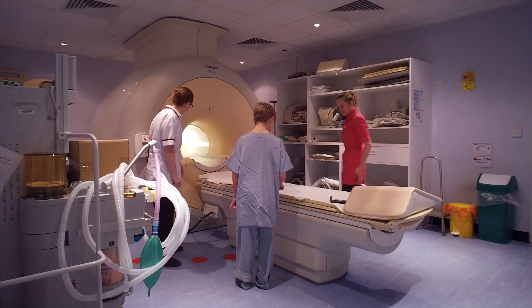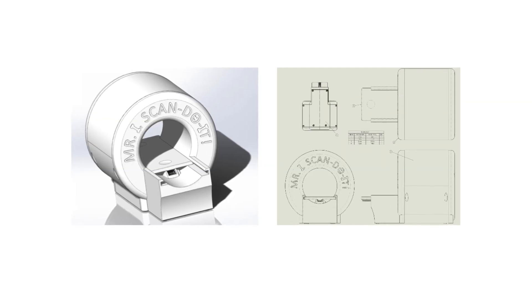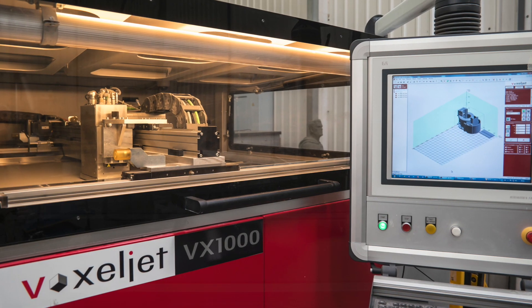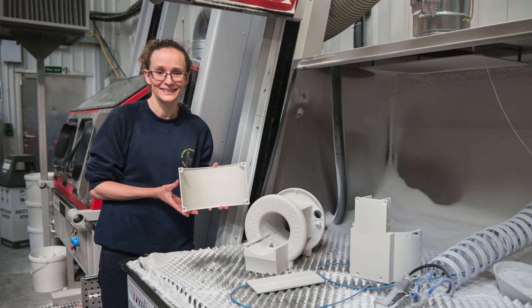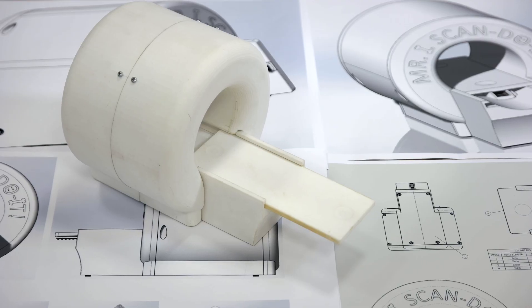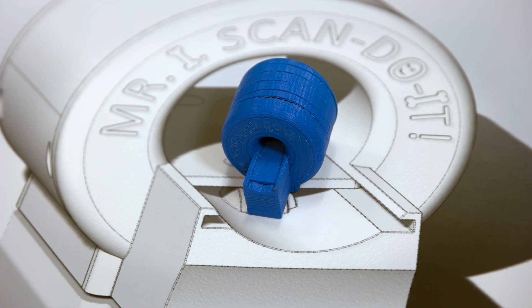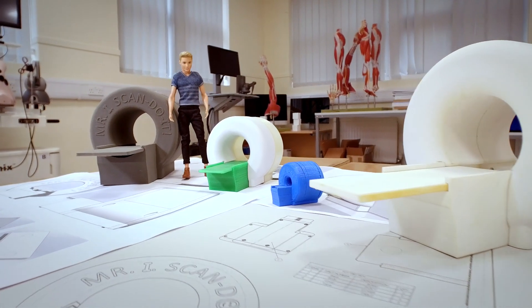MRI scans can be very scary for some patients, both children and adults. To help reassure younger patients, we have developed a mini MRI that helps explain what they are, how they work, and what to expect when undergoing a scan. We developed the mini MRI with our clinical engineering department and produced some models, improving with each version. Now we have a fully working model with noises and lights.